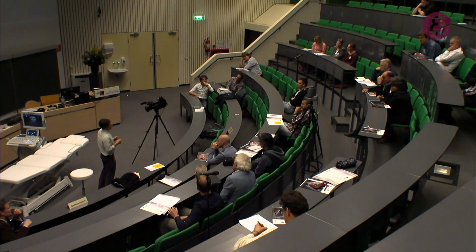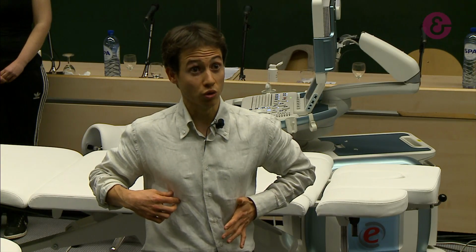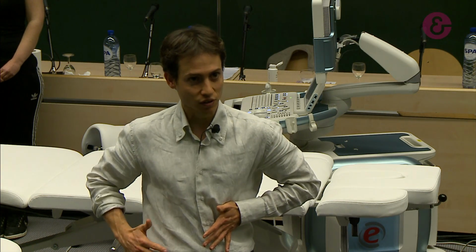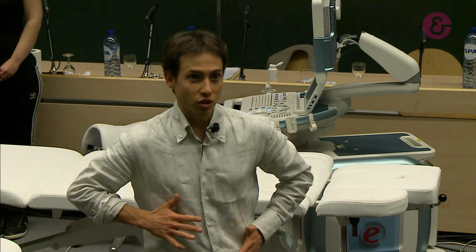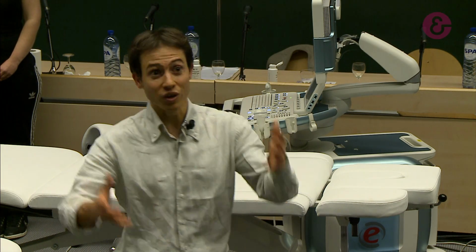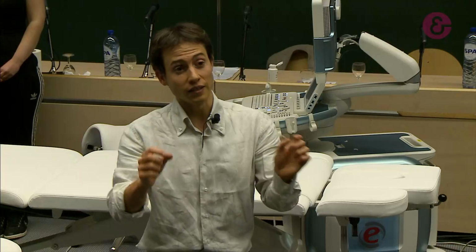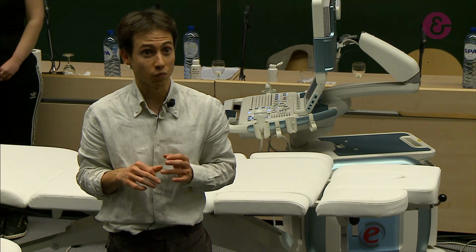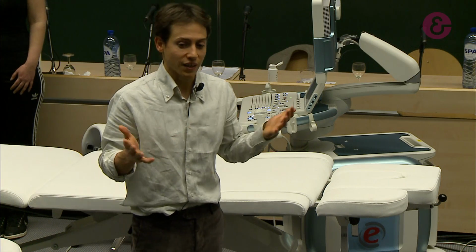And sometimes, for example, if I have a patient with scoliosis and I can check that obliquus externus of the left side is contracted and obliquus internus of the left side is contracted, I try to work in the other position. So I work on the local muscle, but also on the more superficial muscle to keep better posture. And I take measurements before and after the training, if I can try to take measurements.